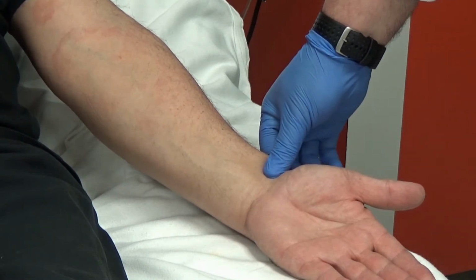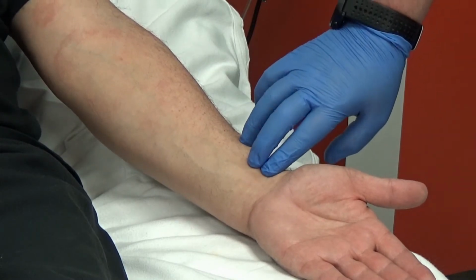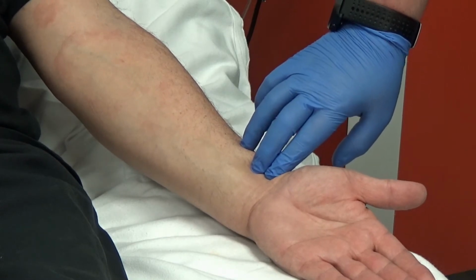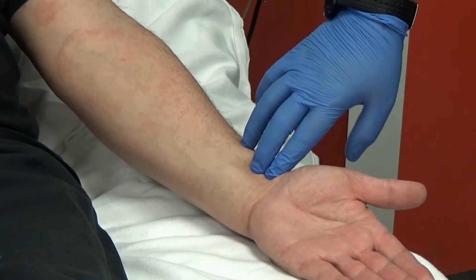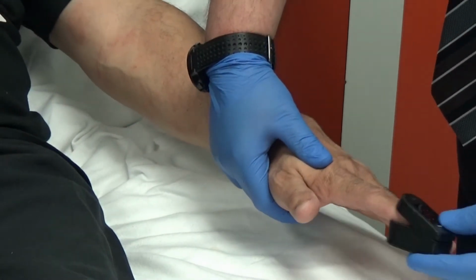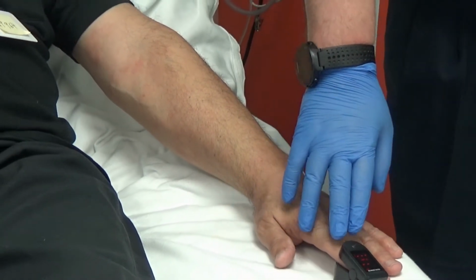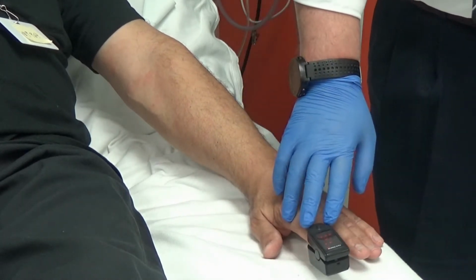Typically, like I said, the radial is the preferred location. Realistically, what you want to do is feel whether this is a normal pulse, whether it is bounding, meaning really strong, or whether it is a weak pulse. You also have a pulse oximeter. You place that on the patient's finger, usually the index finger, and it'll give you the heart rate and the oxygen saturation. So this gives you your pulse rate as well.